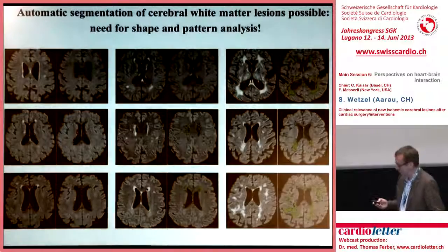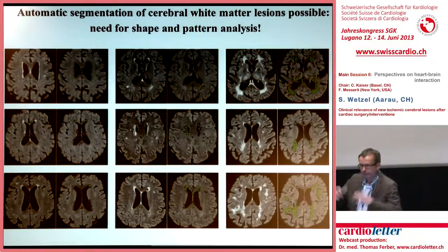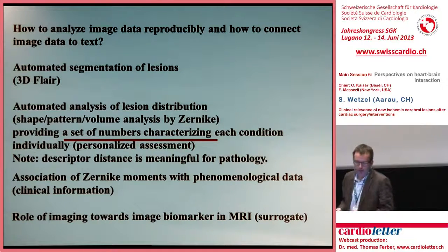And you see here 3 patients with different lesion load, silent infarcts, not severe, here severe, all these infarcts.